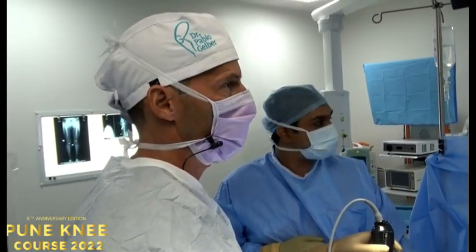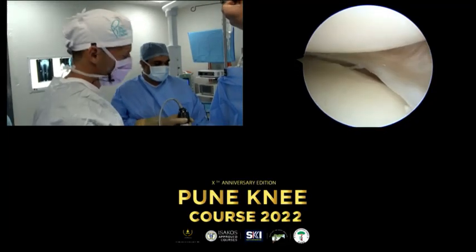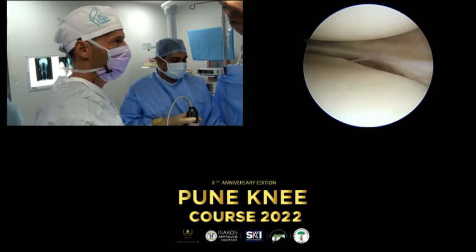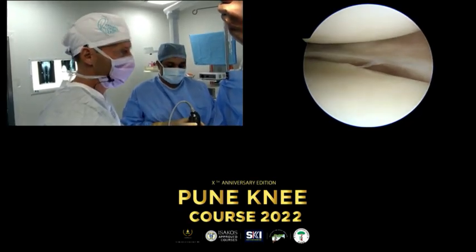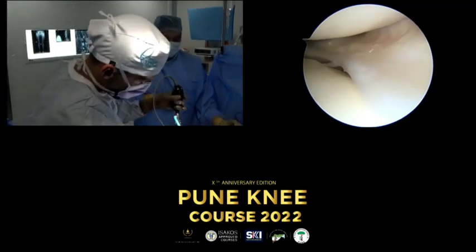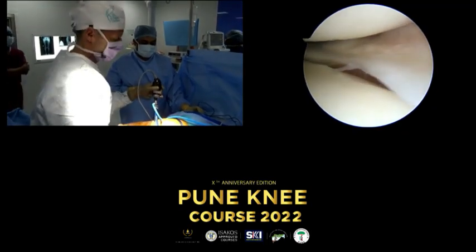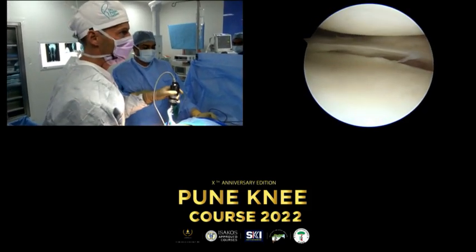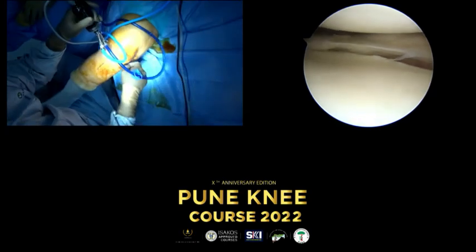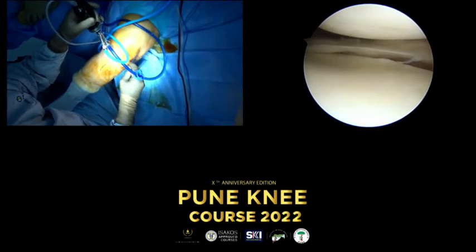Hello, thank you, Sachin. You will have a meniscal transplantation done here on the medial side. I will try to do the best because I'm not used to operating without playing reggaeton, but I think I can make it. So first of all, as we were saying before, I will do the pie crusting of the MCL, though I have enough room. This is a big knee.